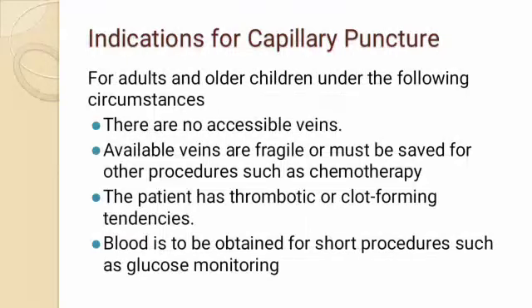Indication for capillary puncture. For adults and older children: there are no accessible veins. Available veins are fragile or must be saved for other procedures such as chemotherapy. The patient has thrombotic or clot forming tendencies. Blood is to be obtained for a short procedure such as glucose monitoring.